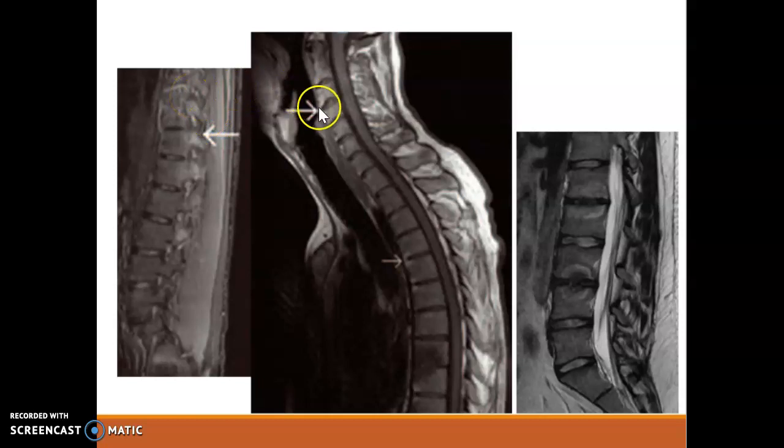Looking at the shiny corners, shiny corners are an indication of ankylosing spondylitis, representing the reactive sclerosis secondary to that inflammatory erosion of the end plates of the vertebra themselves. And then looking at Anderson's lesions, which are shown quite nicely here, these are an inflammatory involvement of the intervertebral discs, again an indication potentially of ankylosing spondylitis.